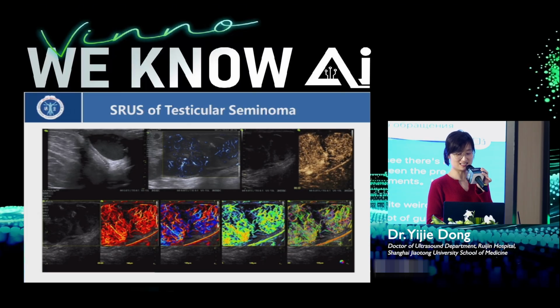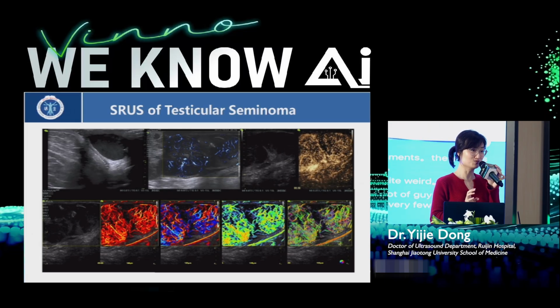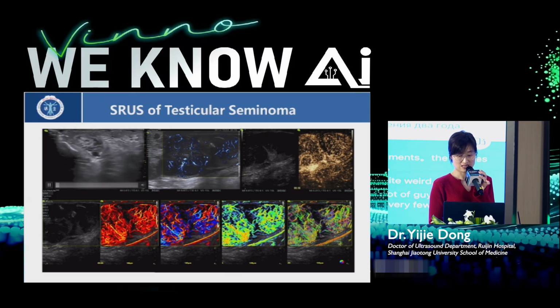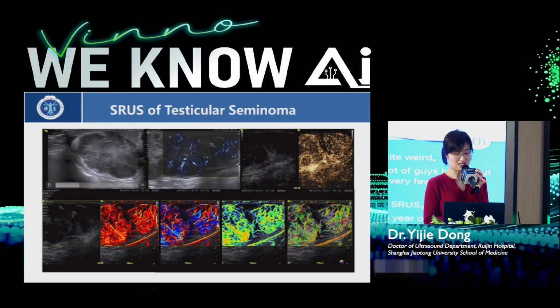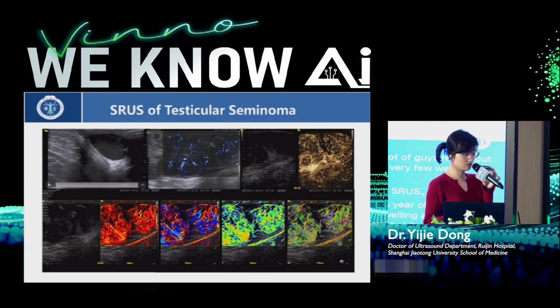He believed that this condition was benign, and he didn't receive any treatment for 2 years. However, the images reveal a significant tumor occupying a large area in both the testicle and the epididymal regions, involved by the tumor.